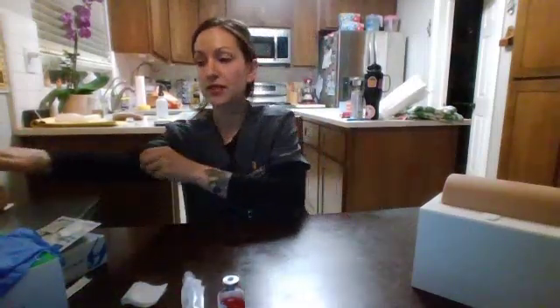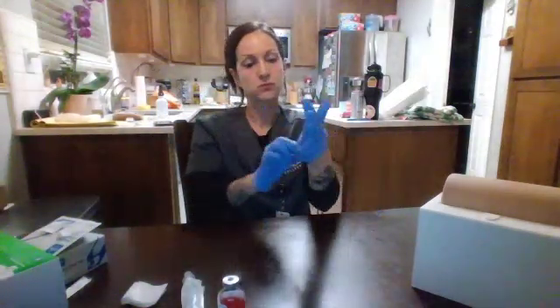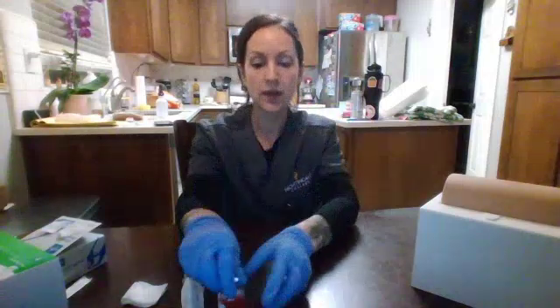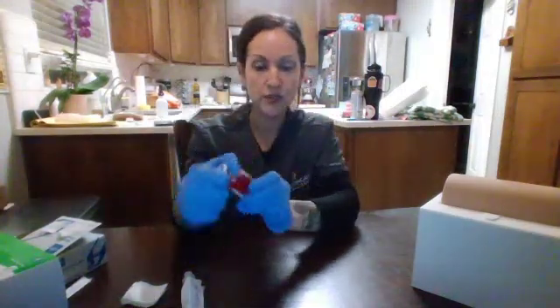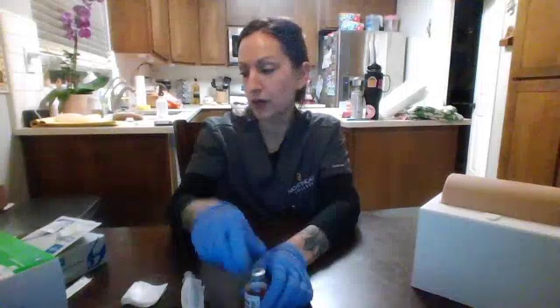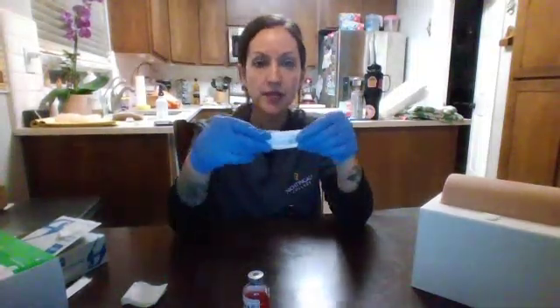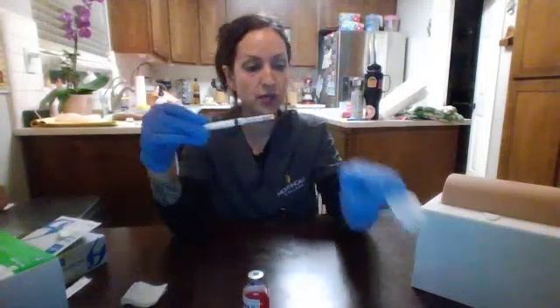No? Okay, so I'm going to perform hand hygiene, and then I'm going to put on some clean gloves. So I confirmed that I have the appropriate medication. So I have my morphine vial here. I'm going to pop off the cap, if there is a cap on here, and discard it in the appropriate sharps container. I'm going to take one of my alcohol prep pads and clean the top of the vial, including the rubber top of the medication. I have my appropriate size syringe, so I have my 3 ml syringe here.